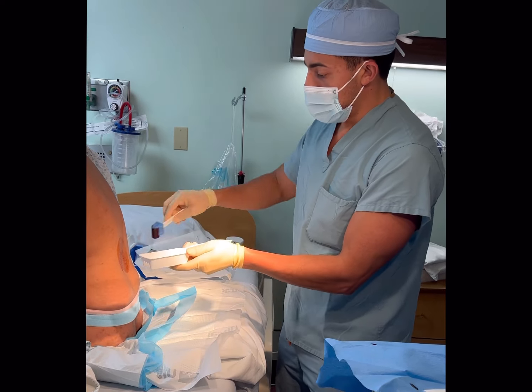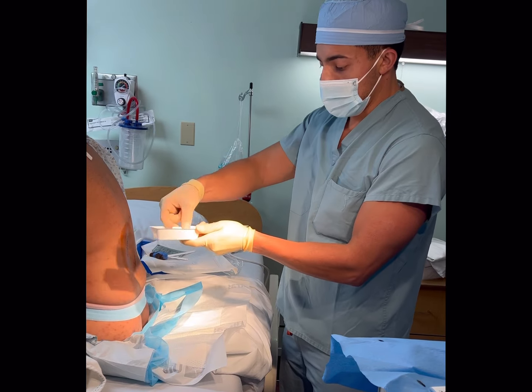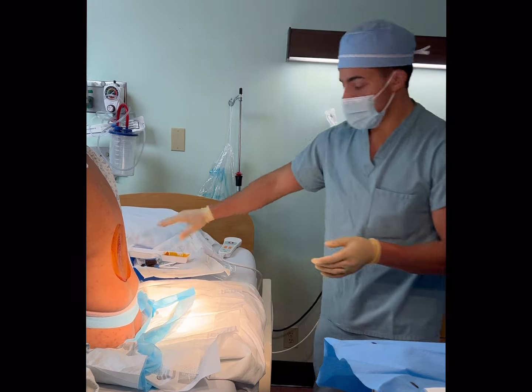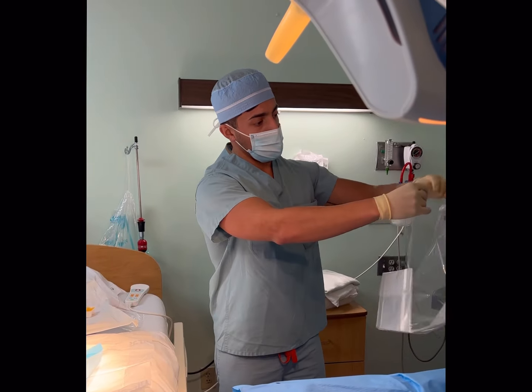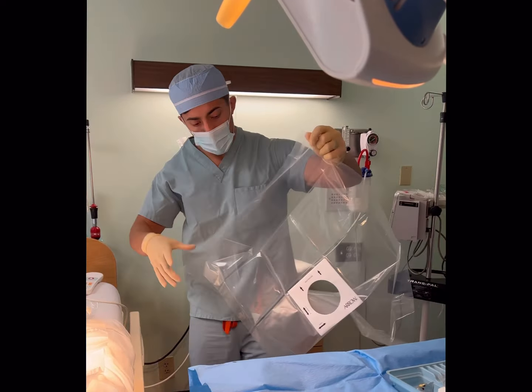Let's go three swaths here of betadine. I like chlorhexidine, but if it doesn't come in the kit or if it's not around, I'll just use betadine, which works just as fine — we use it in the OR all the time. So three swaths here, and I'll just get rid of this stuff. I have my little trash right there in my basket.